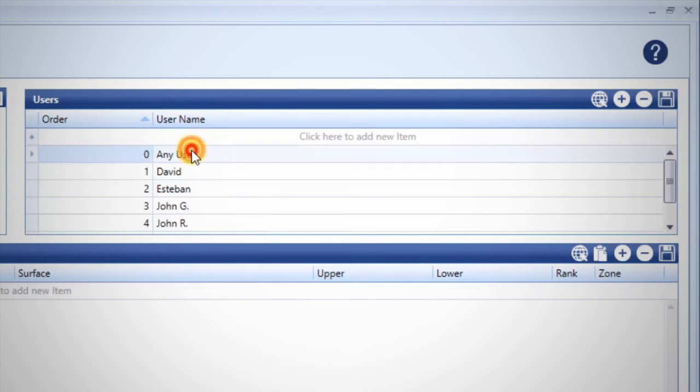You'll see the first row. Any user cannot be overwritten or reprioritized and is there as a backup for when a specific username is not selected during testing.